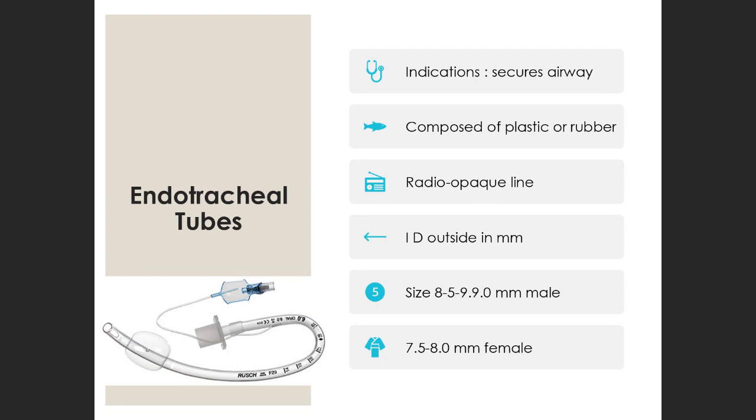This lecture, the PowerPoint, is done by Dr. Minot, and I'm just using it, but I do it a little differently, but we're gonna do it as she has it down here. So endotracheal tubes, what are the indications for it? It means that we're gonna secure the airway, but what does that phrase mean? What does that phrase mean?